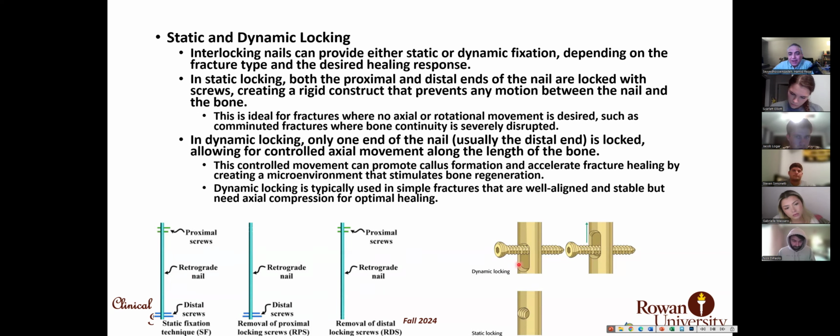Some nails have a dynamic hole. One of the holes is the size of the outer diameter of the screw, so the screw can pass easily through it, but cannot move inside it. But they have another hole that is called a dynamic hole.